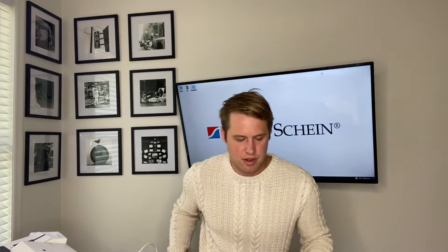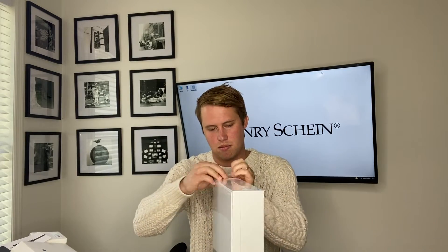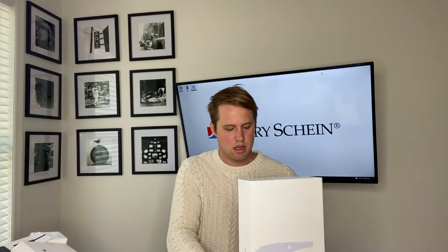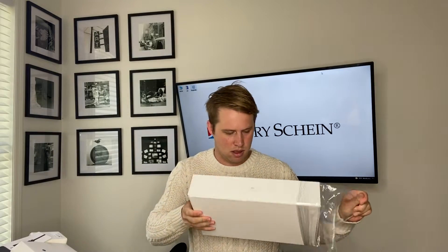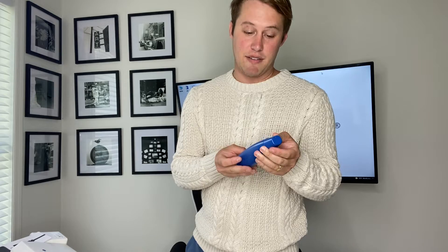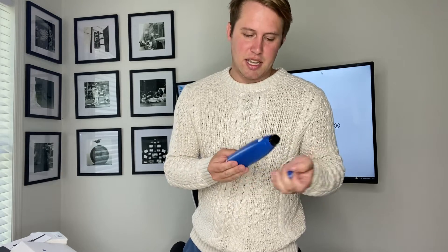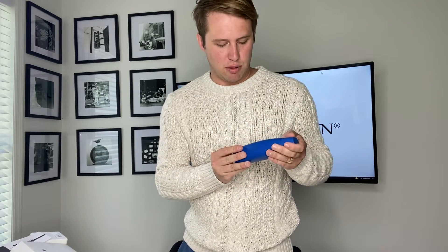Now for the fun stuff - we can open our Medit i600 scanner. Great packaging design. As the middle child of the i500 and the i700, what I see initially about this is the color - it's a beautiful shade of royal blue.